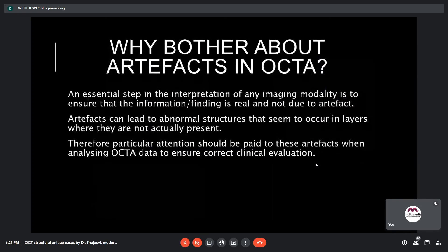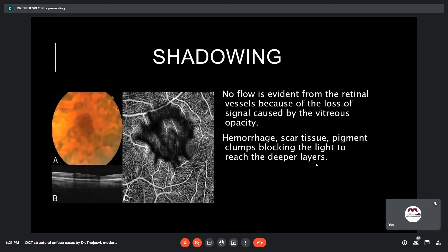Now a few slides on artifacts in OCTA. An essential step in interpreting any imaging modality is ensuring that findings are real and not due to artifacts. Artifacts can lead to abnormal structures appearing in layers where they are not actually present, leading to misdiagnosis. Therefore, particular attention should be paid to artifacts when analyzing OCTA data to ensure correct clinical evaluation. Shadowing due to vitreous opacity — such as a vitreous floater — results in no flow being evident from retinal vessels because of signal loss. Shadowing can also be caused by hemorrhages, scar tissues, or pigment clumps blocking light from reaching deeper layers.